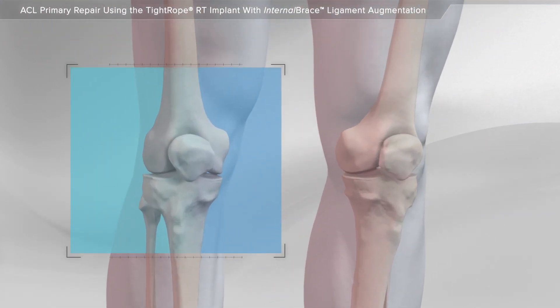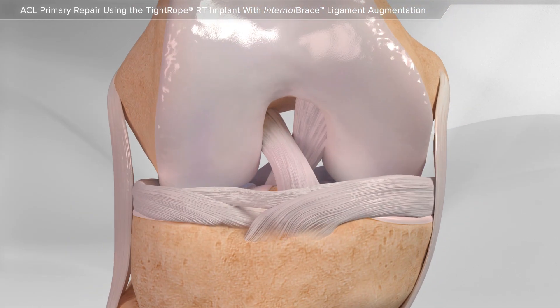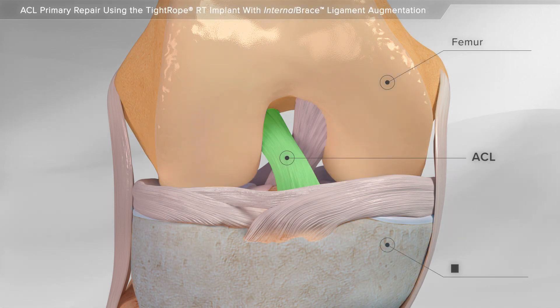In this animation, we will show the repair of the ACL in the knee using Tightrope RT Implant. The ACL is a ligament that stabilizes the femur and the tibia.